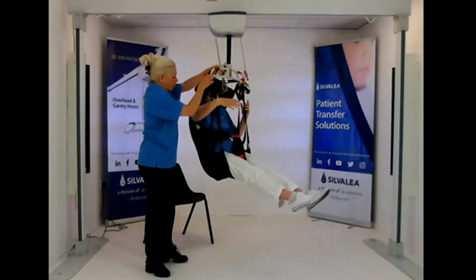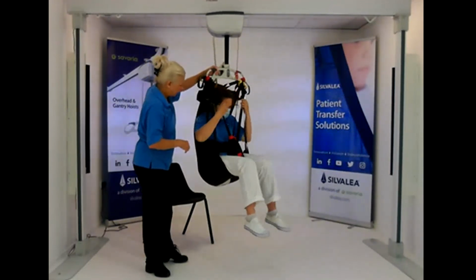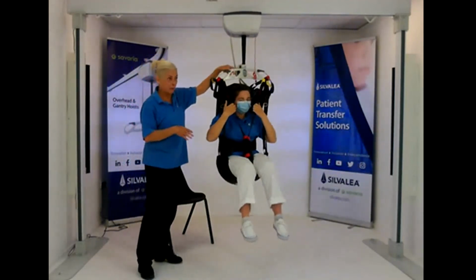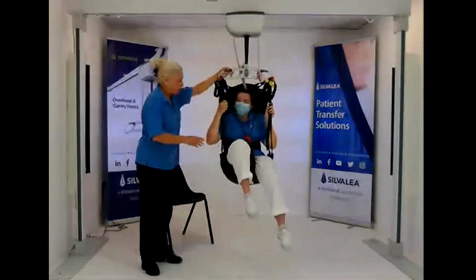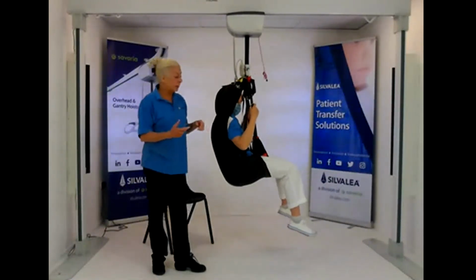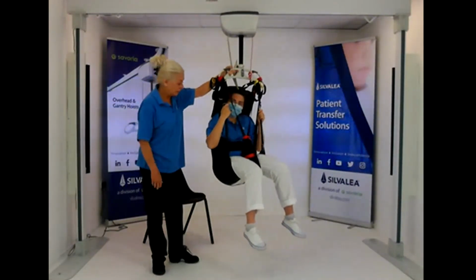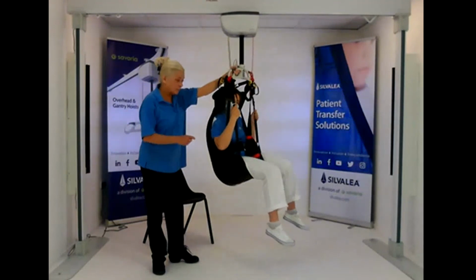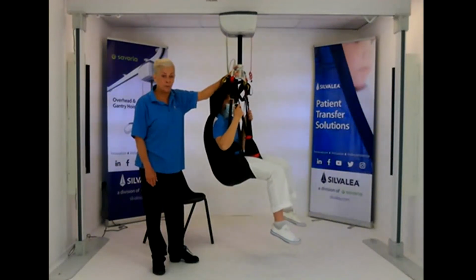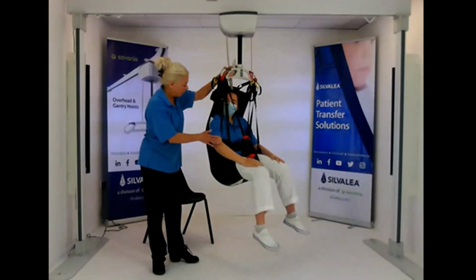And I know one of our guests has said, can you lean forward, get through it forward? Can you pull yourself? You know, if someone's very strong, very determined, as I said, they will go. But I don't know whether shortening the hips, slightly reclining may help. It's a fiddle to try and work it out. And I know it's very difficult when you've got someone that's very challenging, but it has been very successful for a lot of situations. Of course, every style is going to have a limitation when you find someone so extreme. But we had a situation recently where you put your arms inside.